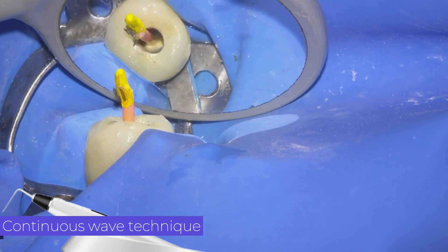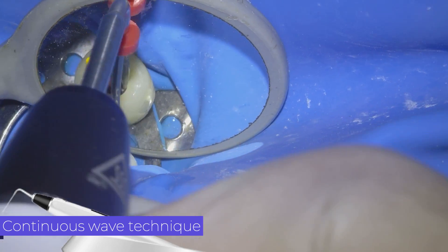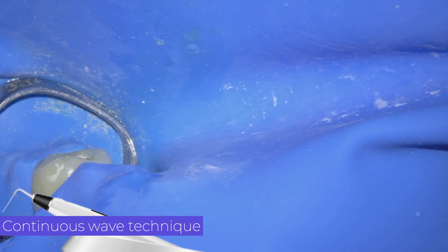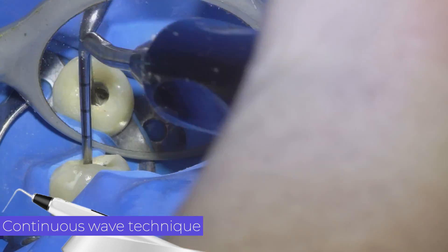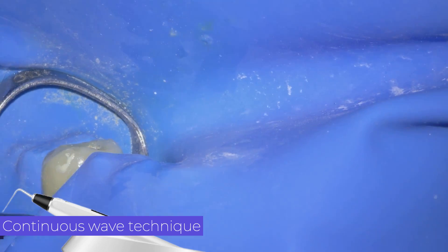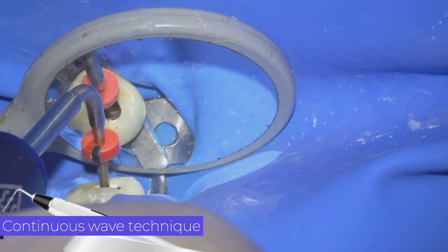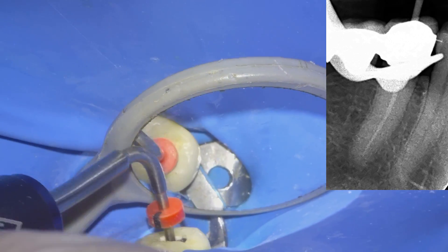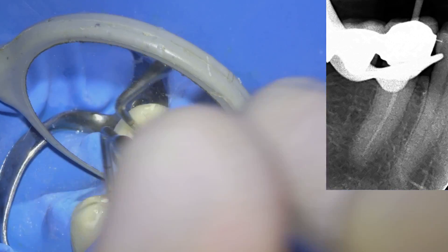The first step of obturation is to place the cement-coated master cone — in this case an epoxy resin sealer. We then sear off the excess gutta-percha. We activate the heat source at 200 degrees Celsius and bring the plugger apically to 3 or 4 millimeters of the working length with light pressure. We wait 10 seconds maintaining apical pressure, then apply heat again while removing the plugger from the canal. We then compact the gutta-percha plug with a fine plugger to compensate for contraction of the material due to cooling.